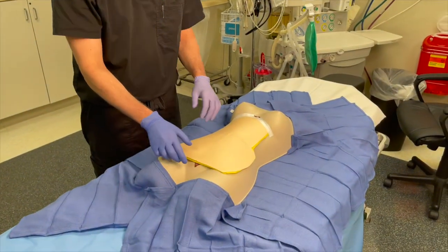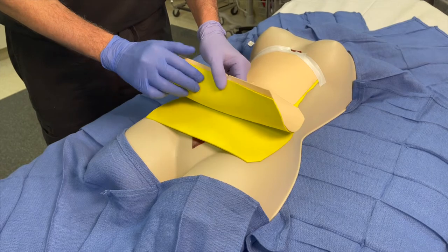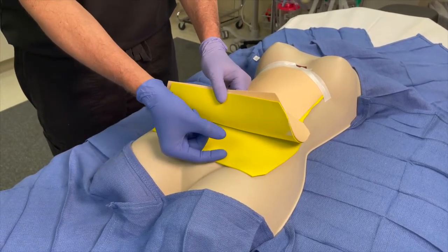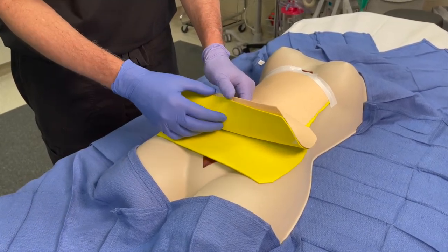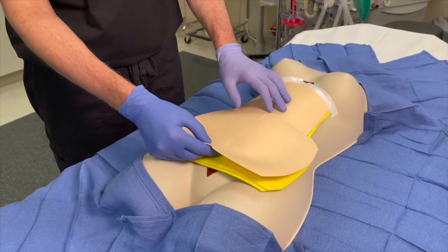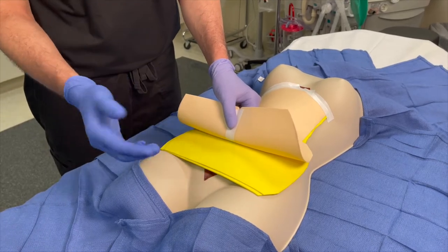Once you go through the skin, you're going to notice that there are two layers of fat. The first layer is called the superficial fat, and then under that is the deep layer of fat. When we're doing liposuction, we are mostly doing it in the deeper layer because that's where you have a thicker layer of fat and where we do most of the volume reduction. In the superficial layer, we can do more liposuction for abdominal etching to get more contour and definition, but you have to be very careful — being too aggressive in the superficial layer can create contour deformities and irregularities.